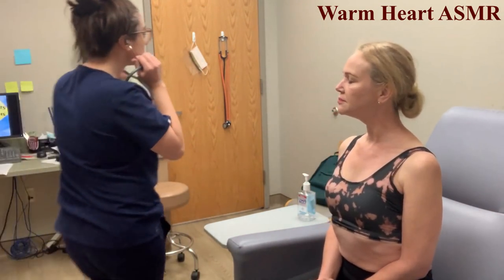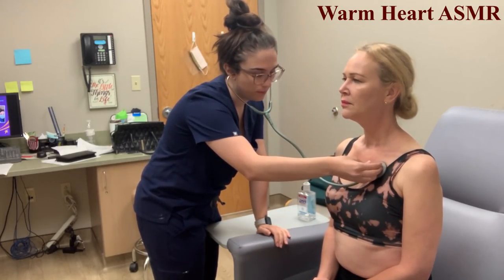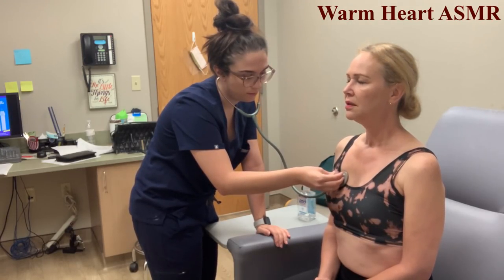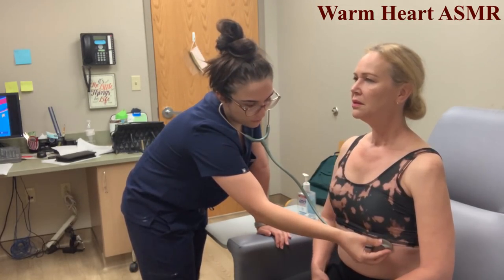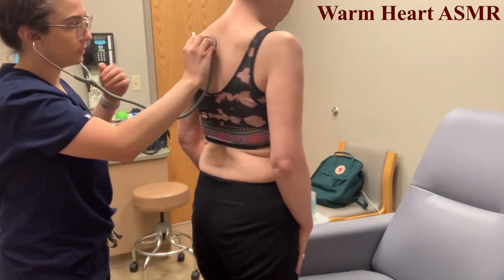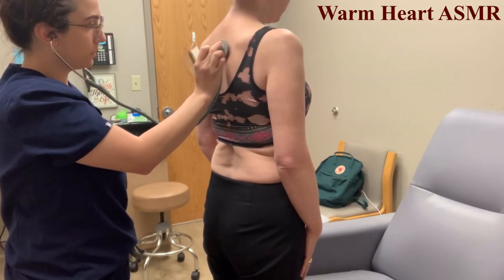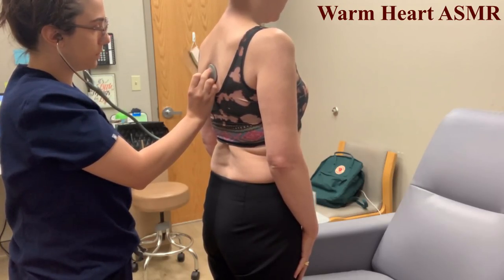Now we're going to auscultate the lung sounds — just breathe for me. Lung sounds are normal on the anterior. Now doing the posterior. All sounds are normal.